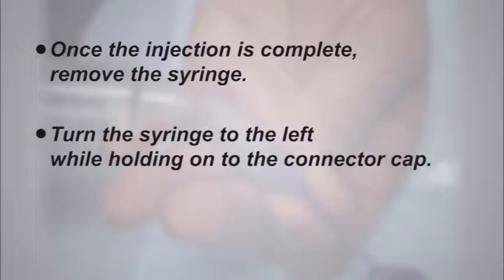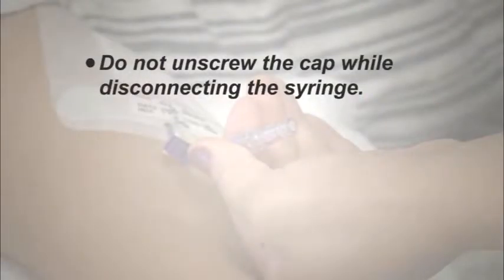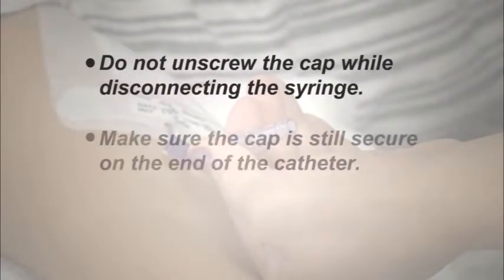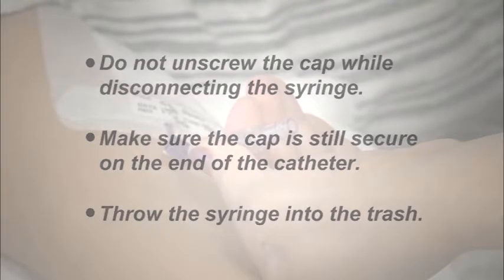Once the injection is complete, remove the syringe. To do so, turn the syringe to the left while holding on to the connector cap. If you have more than one extension, repeat the steps to flush each extension. Do not unscrew the cap while disconnecting the syringe. Make sure the cap is still secure on the end of the catheter. Throw the syringe into the trash.